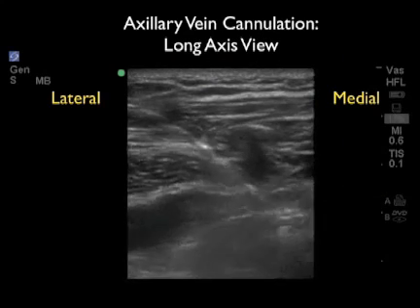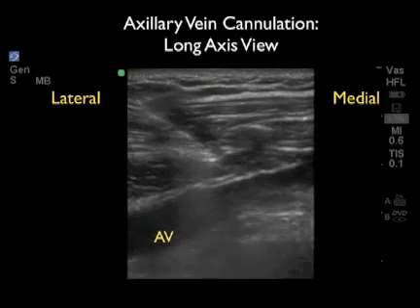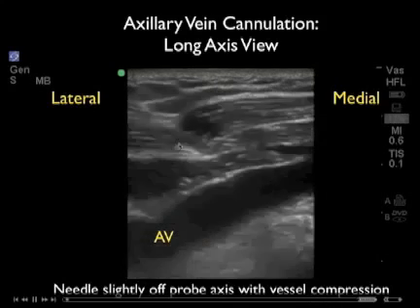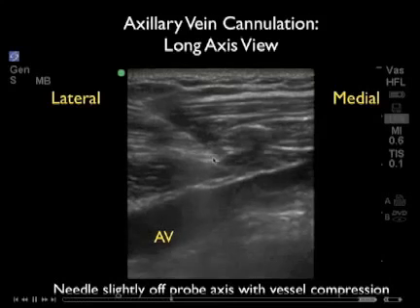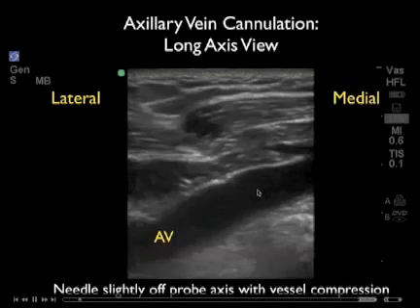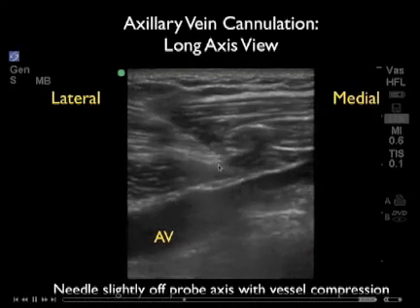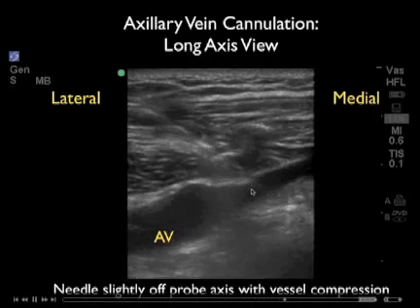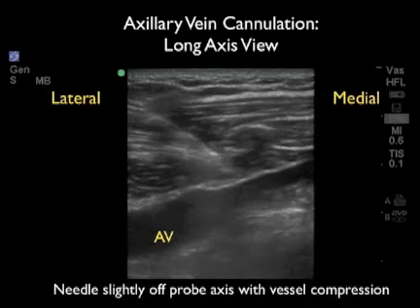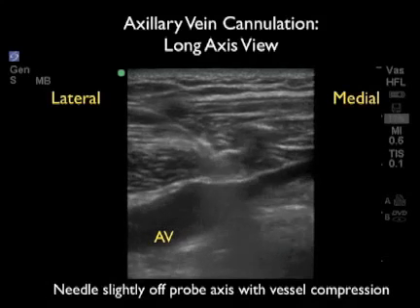Here we see the needle coming down from left to right. We're using the long axis view. Notice that the images are not quite as crisp because the probe is slightly off axis to the vessel. But what we can see here is the tip of the needle, as shown by the small arrow, coming down, pushing down on that anterior wall of the axillary vein, and then entering into the vessel lumen. So in this case, we were able to successfully cannulate the axillary vein, although the images are not quite as clear as in the phantom.